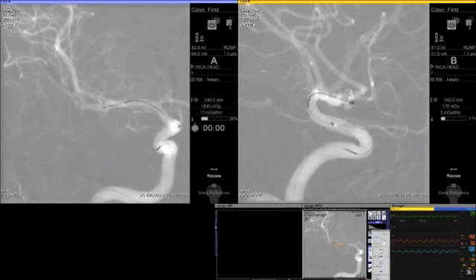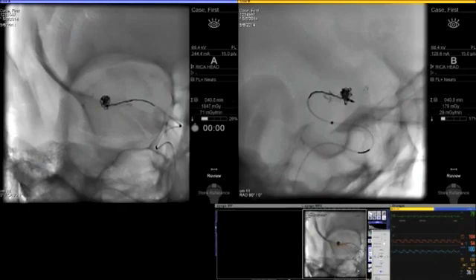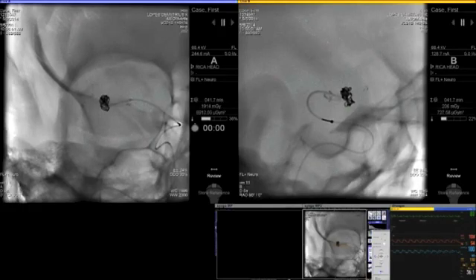And the debate is, if you have 2 stents across the neck of the aneurysm in a Y configuration, especially closed cell stents, if it's needed to have a complete occlusion in the aneurysm. Our feeling is that we'd like to do the best coiling we can do and still have the stents across. So you have the immediate sealing or closure of the aneurysm, as well as the Y stent adding the long-term durability of this treatment. So it's a combination of having an initial closure of the aneurysm as well as a reconstruction of the parent vessels that will provide us the durability of this treatment.